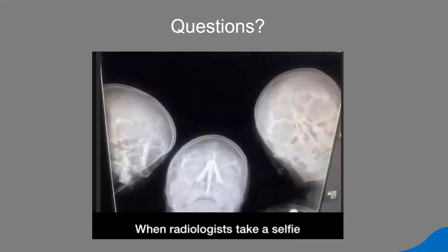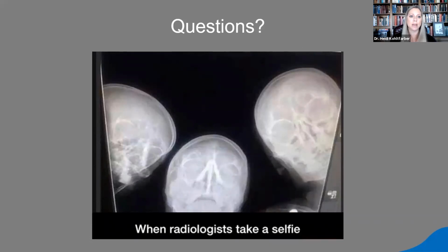Has there been improvement in the overall range and dose of radiation between different manufacturers? Yes, I would say overall yes. In some of the studies done when I was at UNC Chapel Hill, and Dr. Ludlow did all of that dosimetry, by the way, they found that some of the CBCT units were up over 1,000 microsieverts. I believe that unit was taken off the market because of the high dose. Same thing with medical CTs as well.